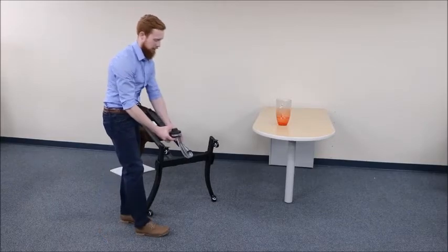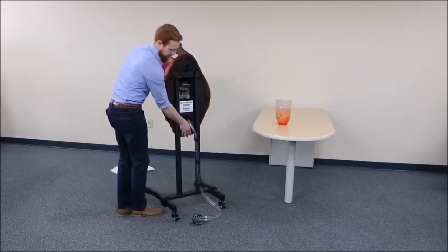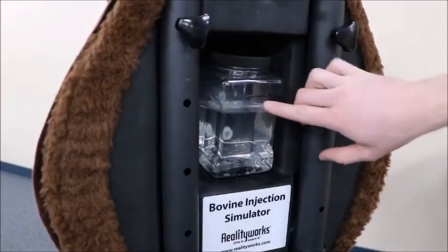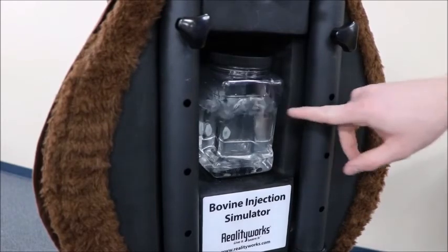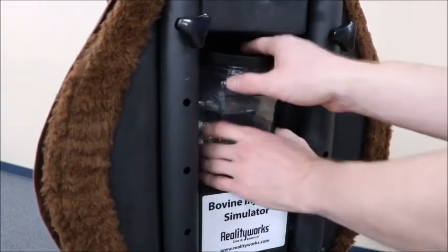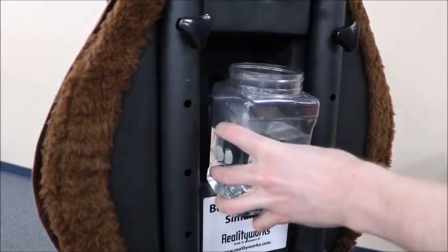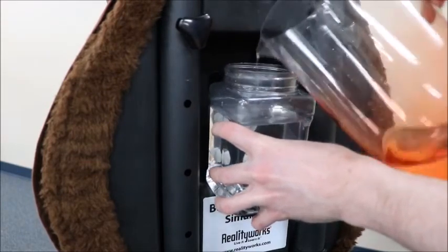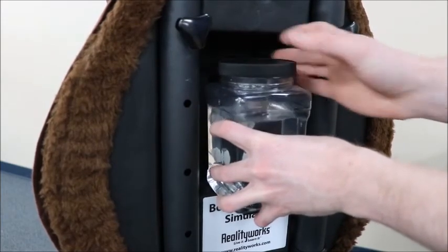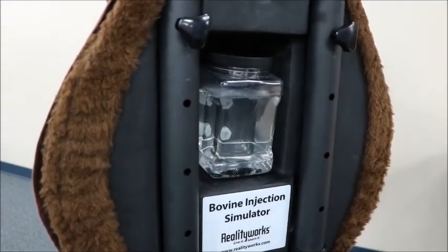Once there are no more bubbles coming through, bring it back up onto its legs. If the water returning to the reservoir is above the water level inside, it might make quite a bit of sound, which will obviously tell the student when the heart is beating. To fix that, remove the reservoir and fill it so that the water level is above the line of tubing coming in the top. Tighten the lid back on and you're ready to go.